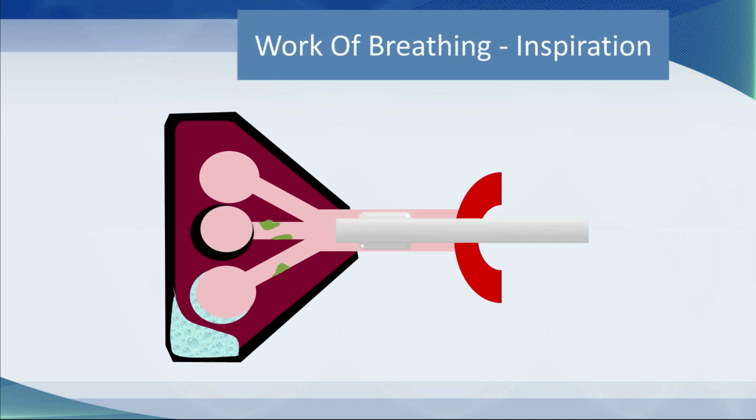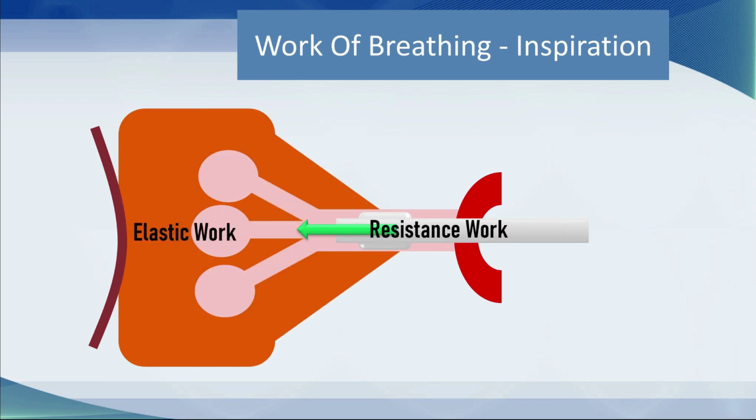In this scenario, we have a patient who is intubated and there's an endotracheal tube in the trachea, and I've drawn a small number of alveoli, and you can see that there is slimy material in the airways. Some of the airways are inflamed and there's some hydrothorax, that's a pleural effusion, some pulmonary edema. When the patient tries to breathe here, they take a breath, their diaphragm descends, and they have to drag gas through the endotracheal tube and then open up their lungs.